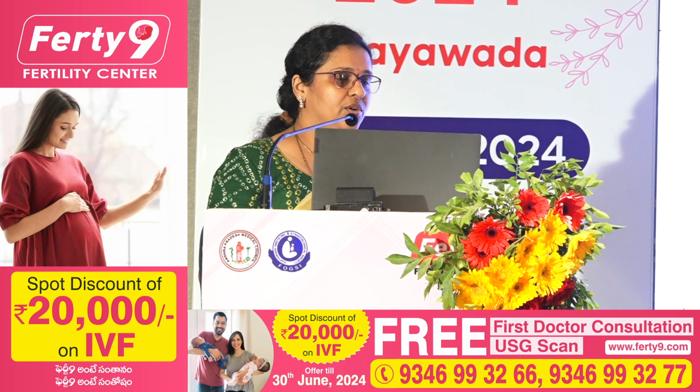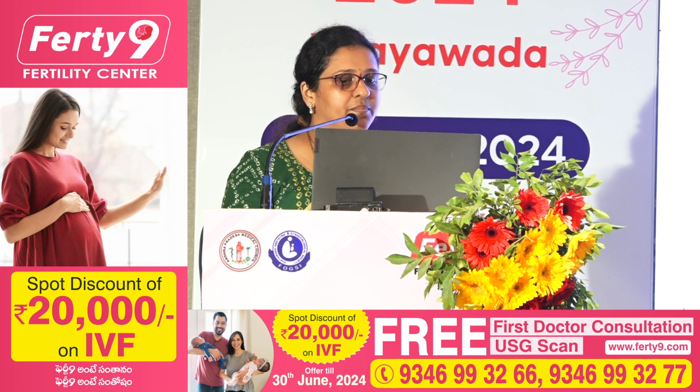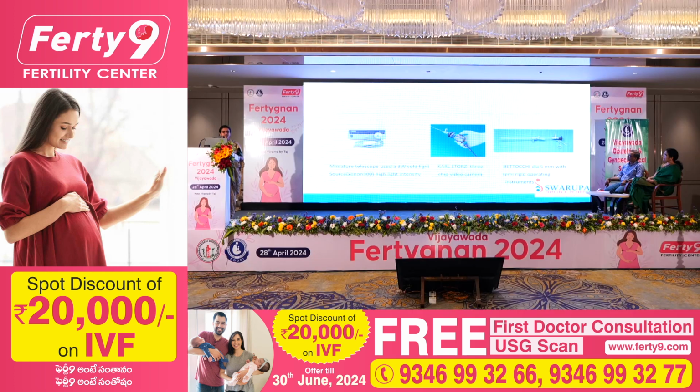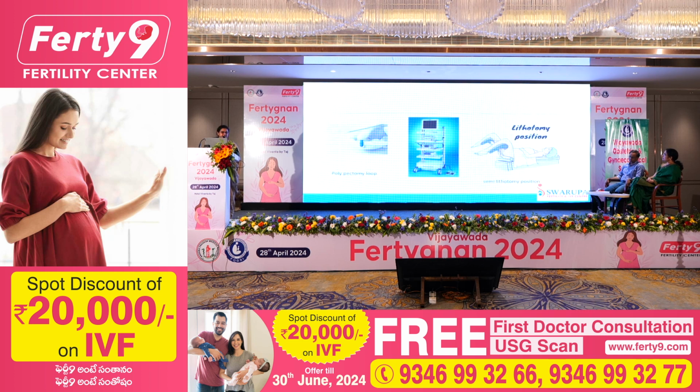Remember that to see the uterine cavity, the basic wattage should be around 150 watts when you are buying a light source. For the fiber optic smallest of the hysteroscopes, you need as high as 300 watts. And the video cameras have gone from a single chip to 3 chip and now have come the HDs. Lithotomy position is the ideal position to do your hysteroscopy. This is an endoscopic trolley which has to be there in your theatre.